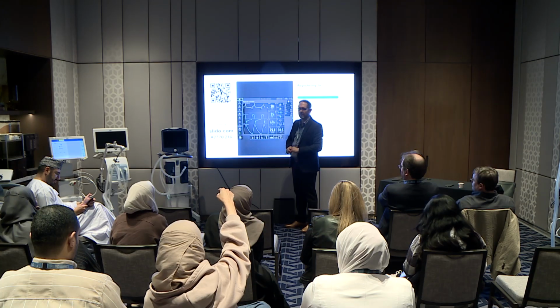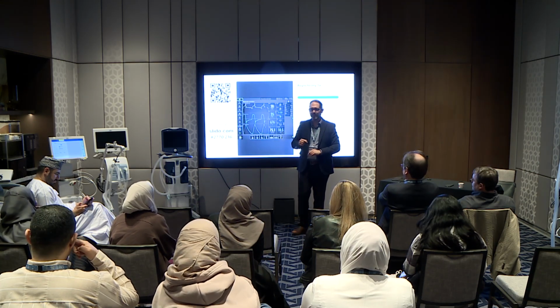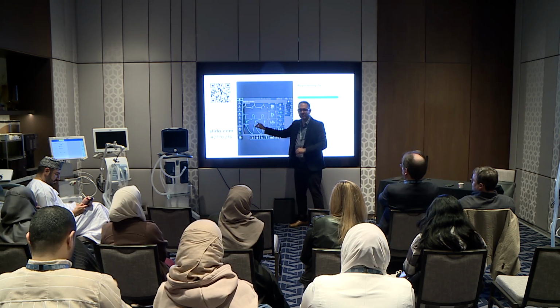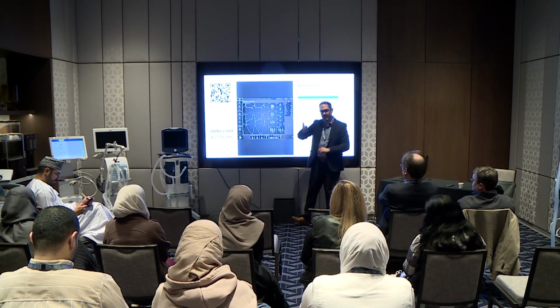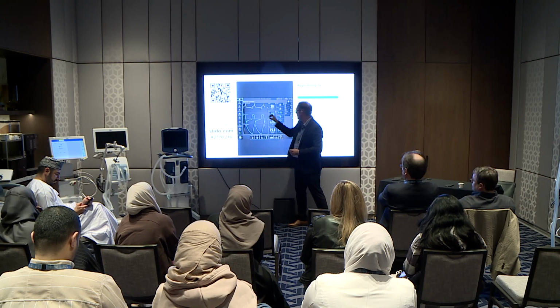Big pressure above the pressure. Yes, so this is delayed cycling, or late cycling. Okay. So with early cycling, you're going to see a blunting of the expiratory flow because effort continues on when the ventilator cycles off. Late cycling in this mode, for example, they're making very strong effort.